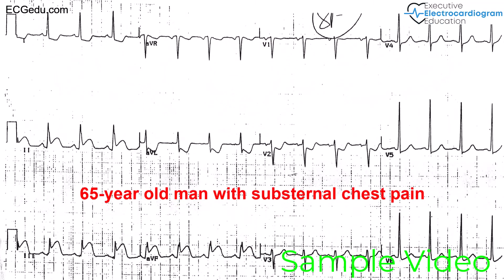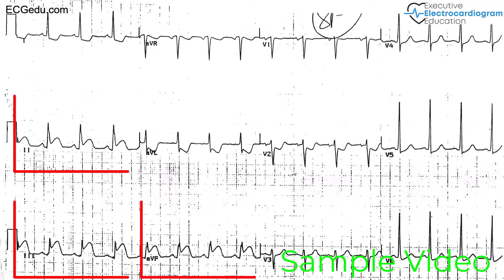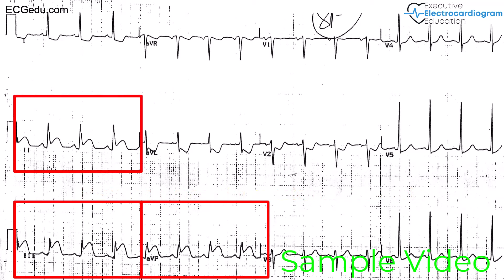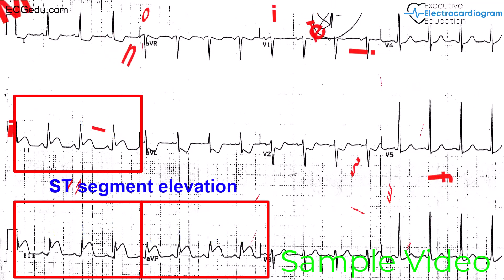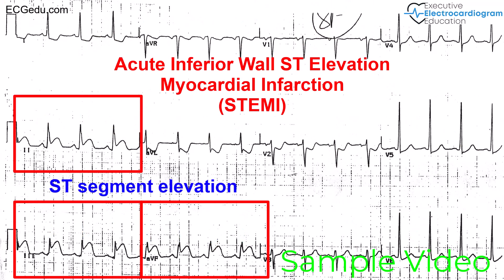This 65-year-old man presented to the emergency room complaining of severe substernal chest pressure that started an hour earlier. If you look at leads 2, 3, and AVF, the ST-segments are elevated above baseline. This patient is having an acute inferior wall myocardial infarction.